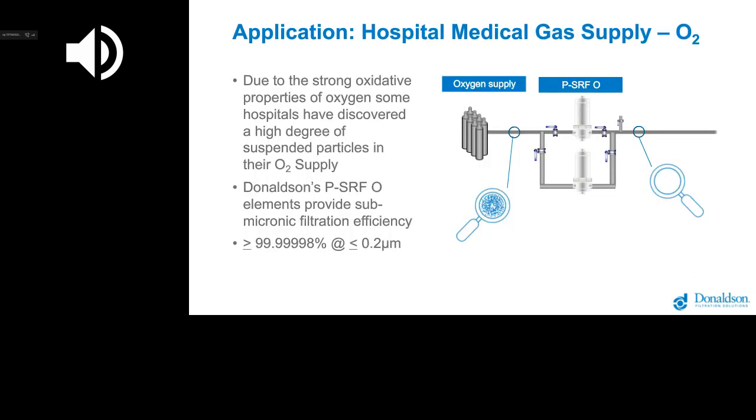We'd like to raise a couple of other points that you may come across. A lot of hospitals, as mentioned, will have a medical gas supply for oxygen. And what we have seen, due to the strong oxidative properties of oxygen, is that hospitals have found a high degree of suspended particles in their oxygen supply. This has proved problematical for a number of installations.